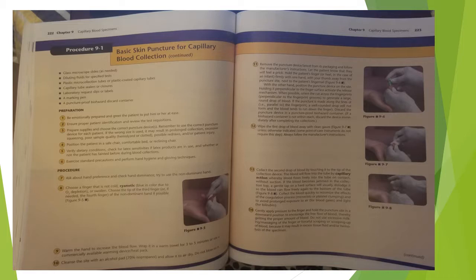The blood will flow into the tube by capillary action, whereby blood flows freely into the tube on contact without suction. If the blood becomes jammed in the collection tip, a gentle tap on a hard surface will usually dislodge it so the blood can flow freely again to the bottom of the tube.